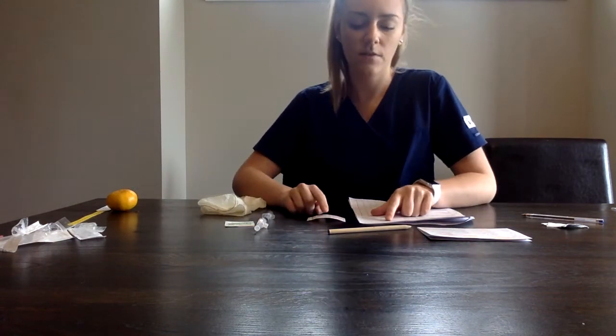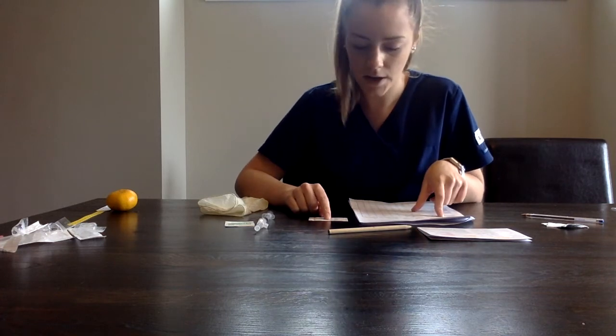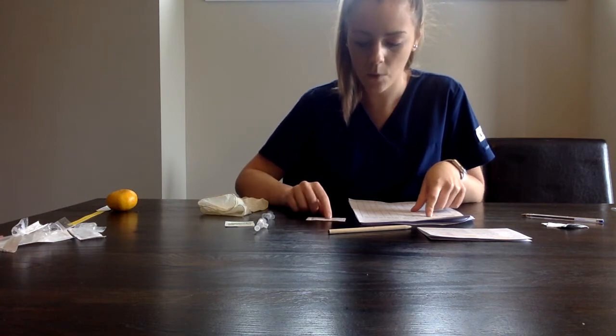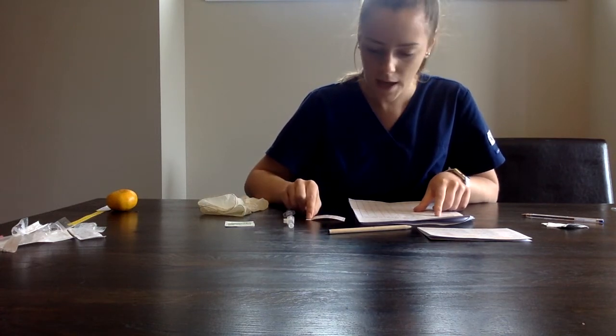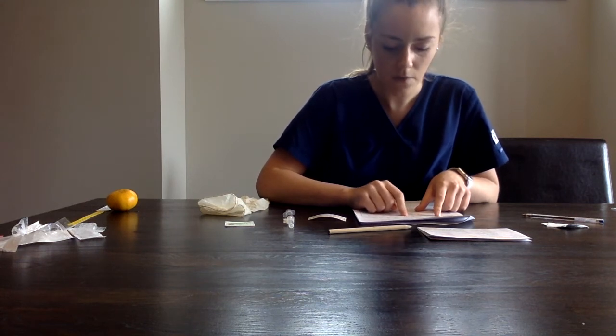We'll do our third med check. So we have nursing Jake, and we just verified we have nursing Jake. Hydromorphone, we have the correct drug. 2 milligrams is our dose. Concentration is 2 milligrams per ml. So we have 1 ml for our volume. We'll verify we have 1 ml. There's no bubbles, and we have a bleb at the top of our needle. It's subcut. BID, it's March 10th. We're giving for 2030 because that's not signed off on yet.